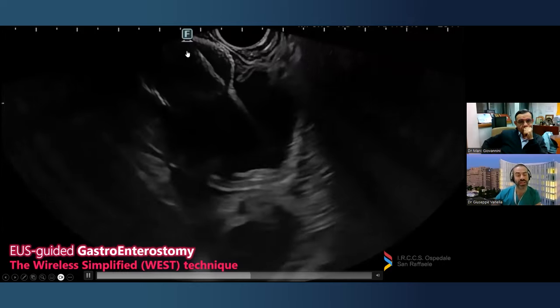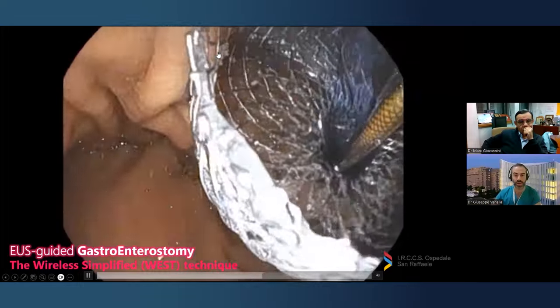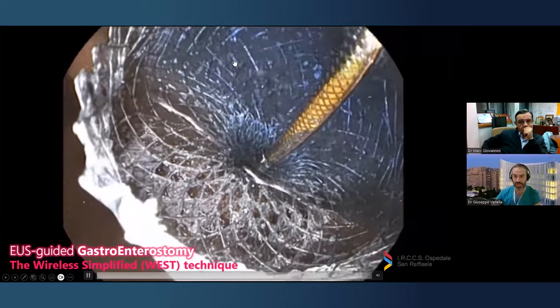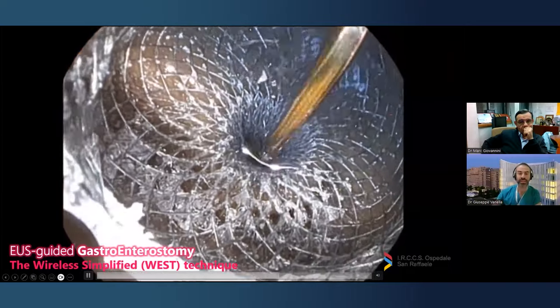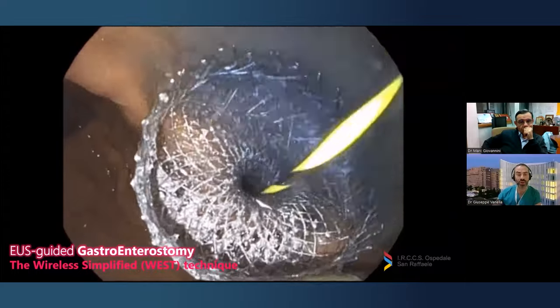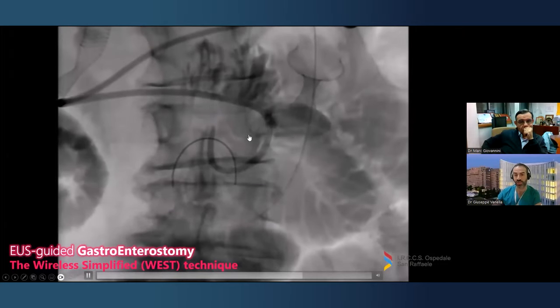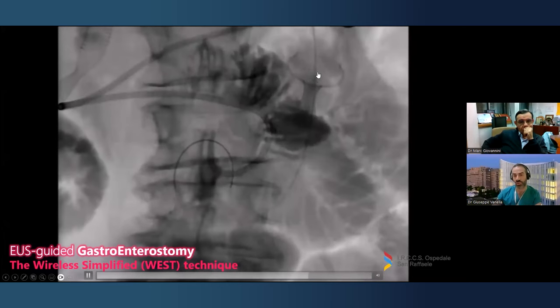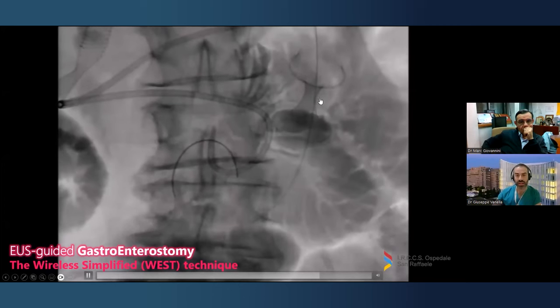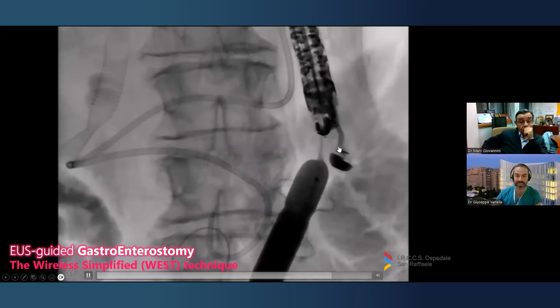But then we retract the LAMS to oppose the two walls. And then we release our proximal flange. And we see some reassuring blue inside the stomach, because we also use indigo carmine in the saline for injection. And at this step, if you want, you can confirm your correct placement by sending some contrast in the oral jejunal tube, and you can see contrast flowing through your LAMS into the stomach. In our center, after this step, we also dilate, but I know this is not standardized. Michiel doesn't do that.